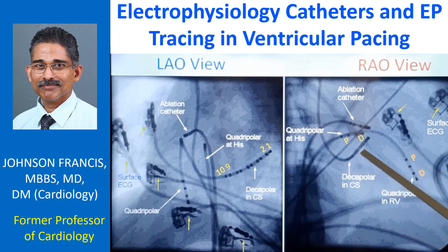This is another view of the same catheter, decapolar catheter in the coronary sinus. Quadripolar in the His bundle region. These are the two proximal electrodes and these are the two distal electrodes.